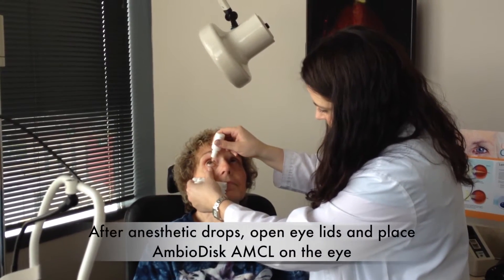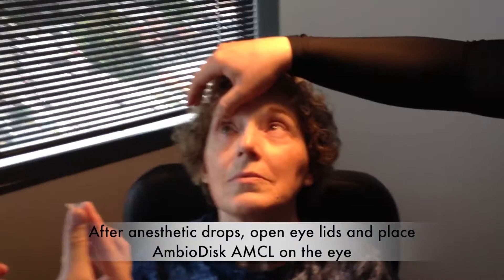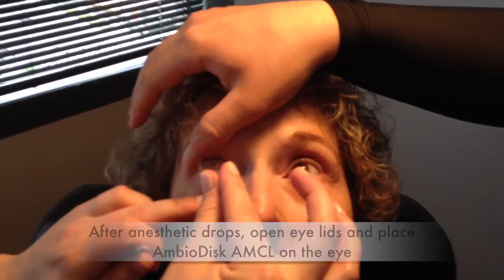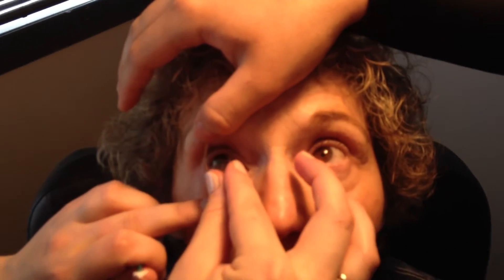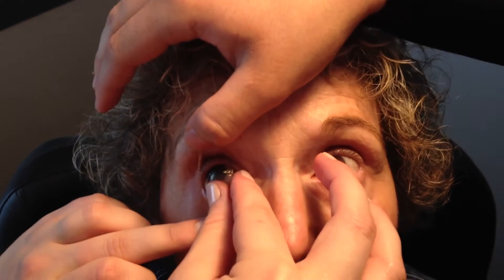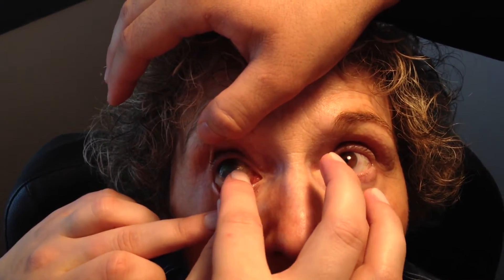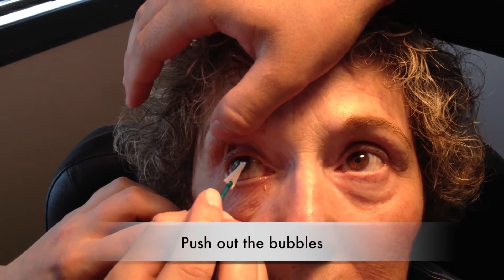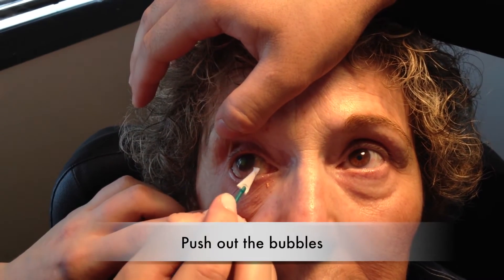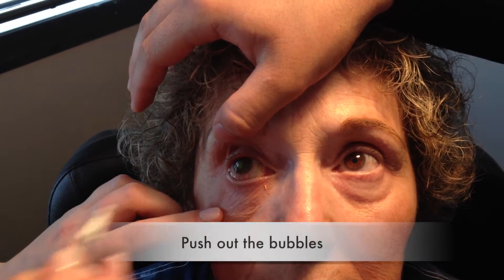With a topical numbing drop, we found that we don't have to use a speculum at all. We just put the amniomembrane contact lens on top of the corneal surface, have the patient look up, and use a cellulose sponge to make sure the bubbles are squeezed out from underneath the surface.